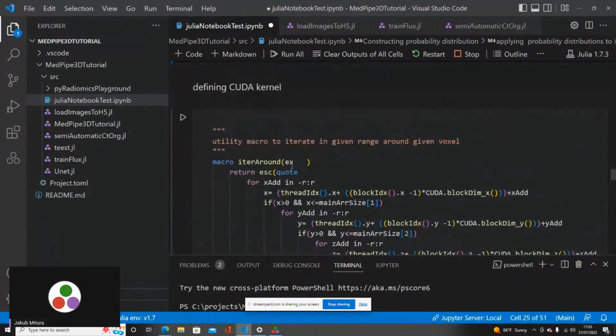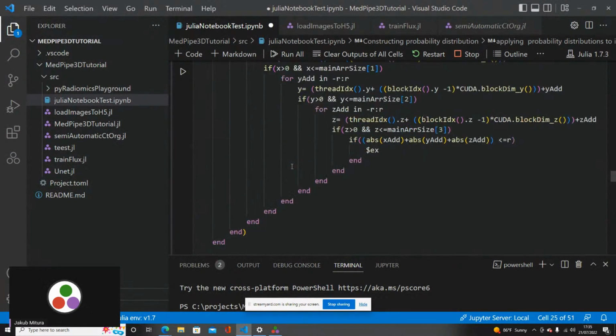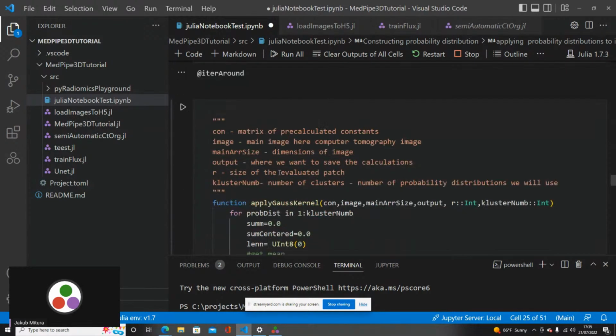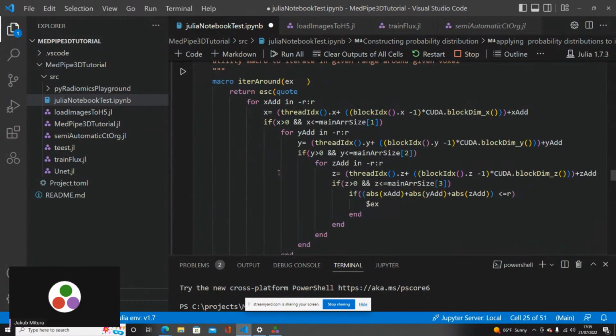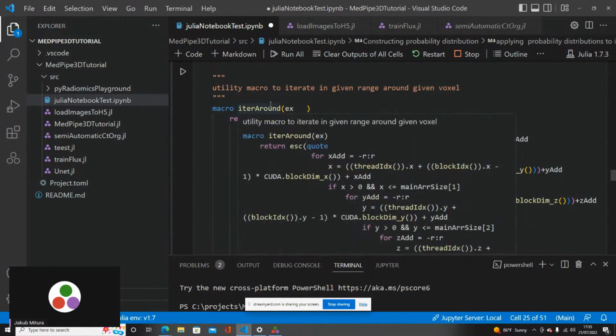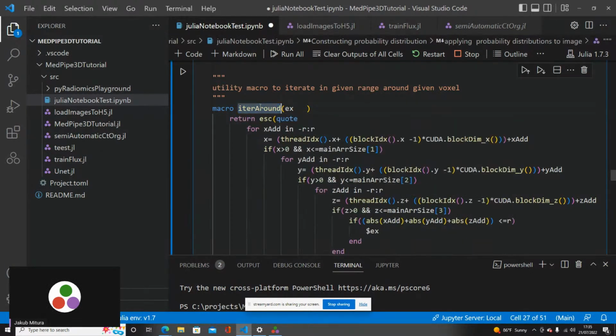Okay. So how to speed it up? The best way, basically, I suppose at least, is to execute this in the GPU using this massively parallel framework that I described earlier. First of all, this is for convenience. This is how I like to do it. There are a lot of different ideas. This is macro for the iteration.